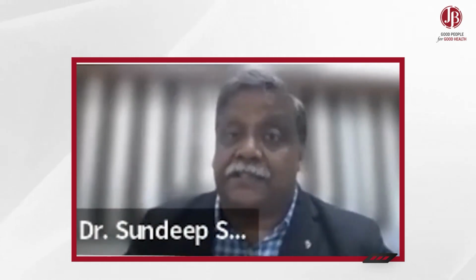FEV1 divided by FVC is less than 70%. That is diagnostic of obstructive airway disease. Okay, that ratio, FEV1 upon FVC, if it is less than 70%, it is obstructive airway disease. The second point, as I told you, the plateau is reached by about 2 seconds in a normal, healthy individual. 2 seconds. After 2 seconds, it's a flat line.